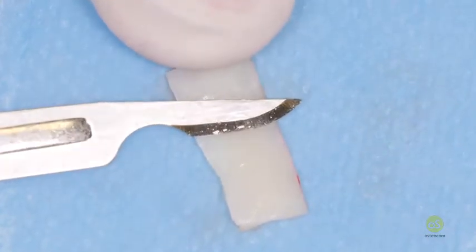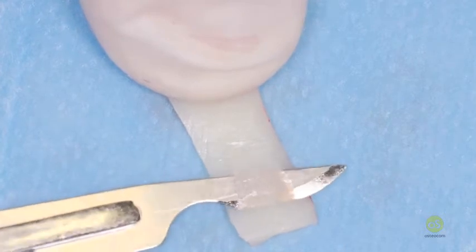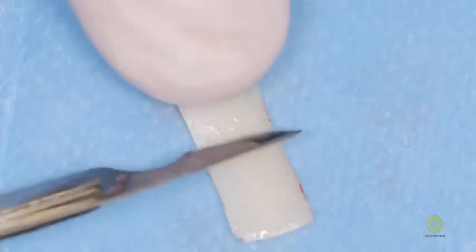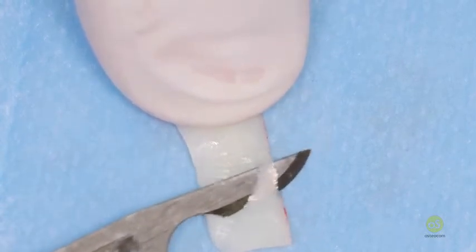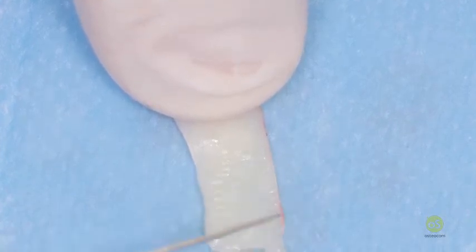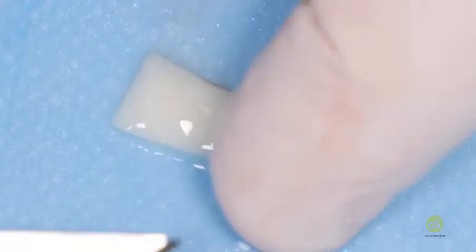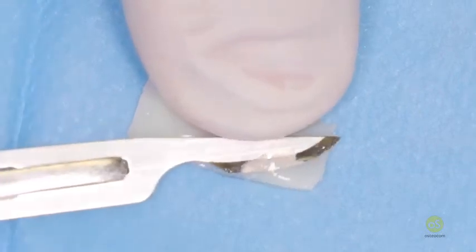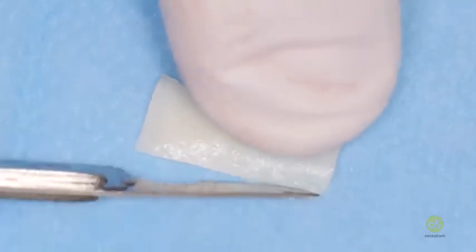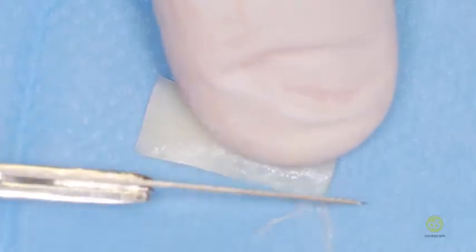Now, blade oblique. Desepithelialization. Desepithelialization, and there is still an area here. Right. You need some saline in order to improve the cutting properties of your blade, especially when you reach the peripheral area.